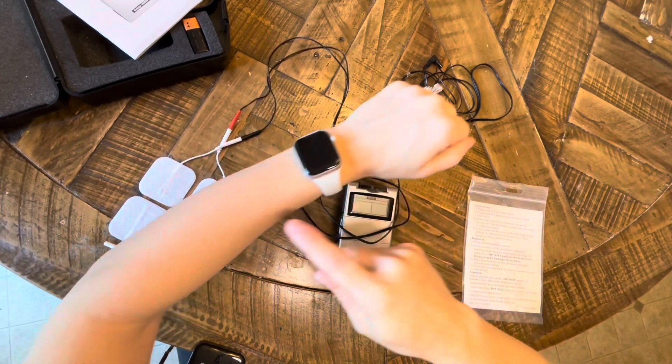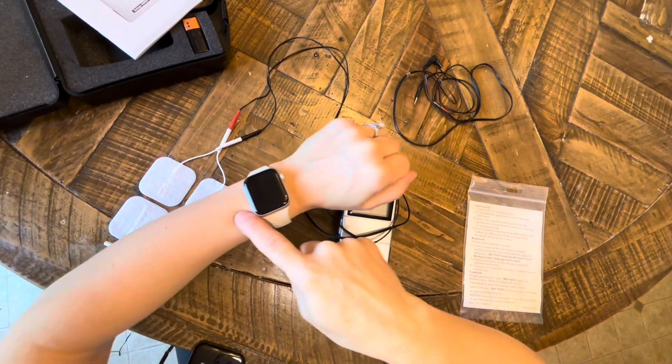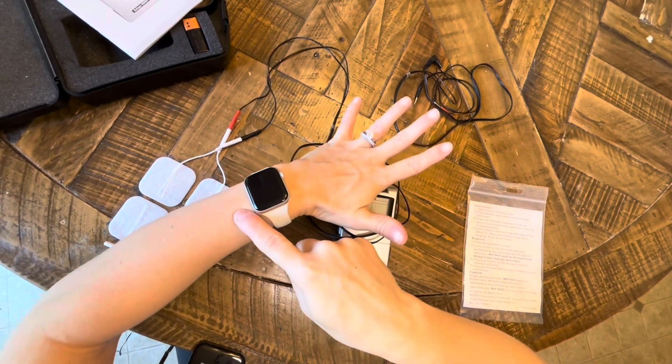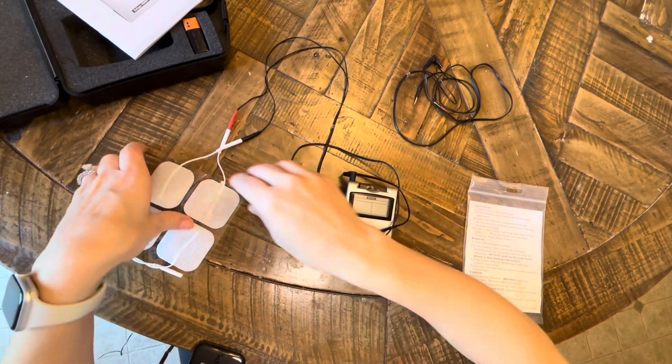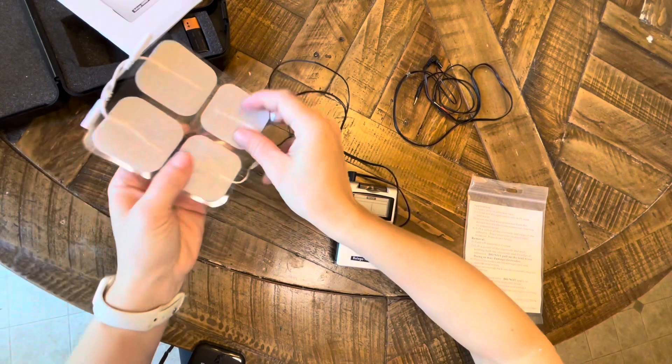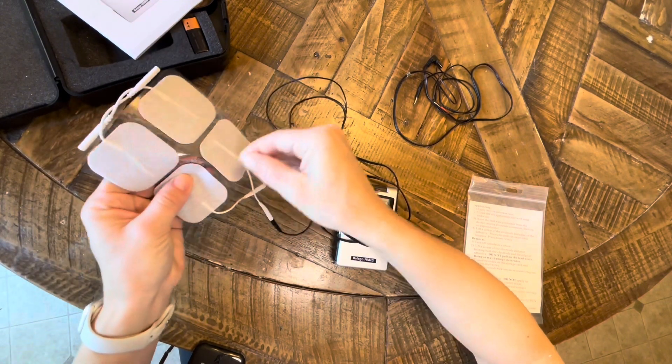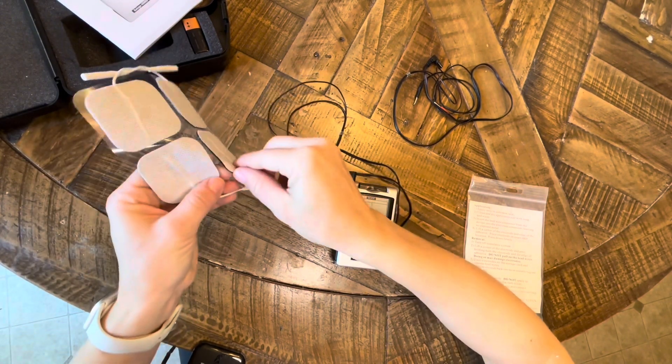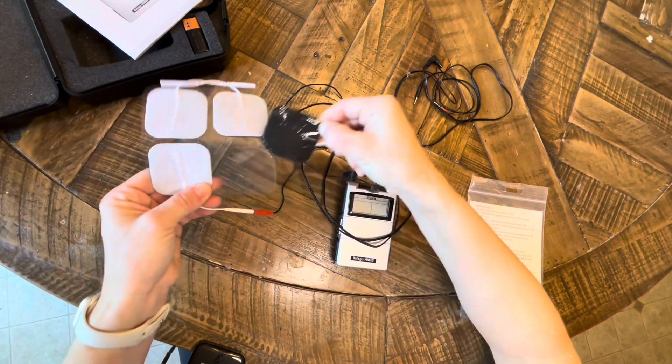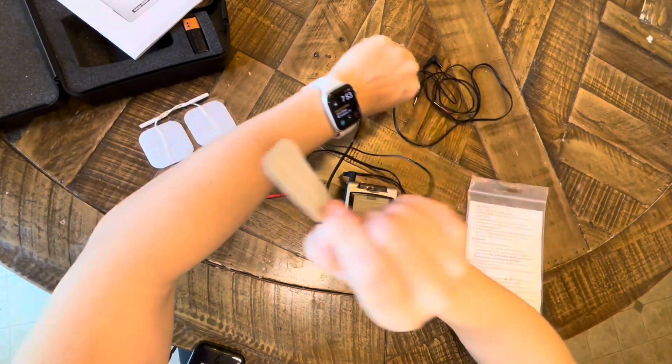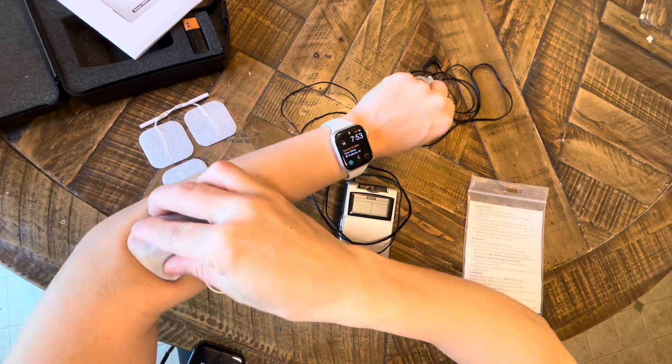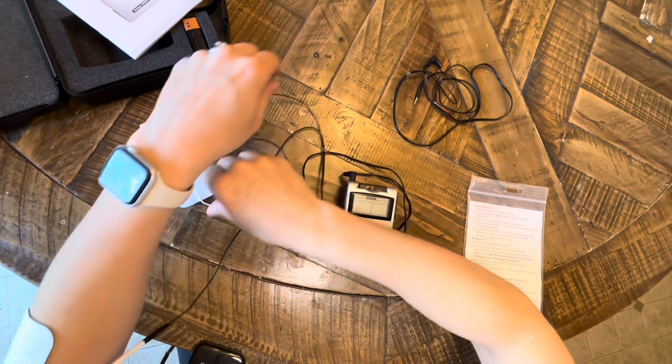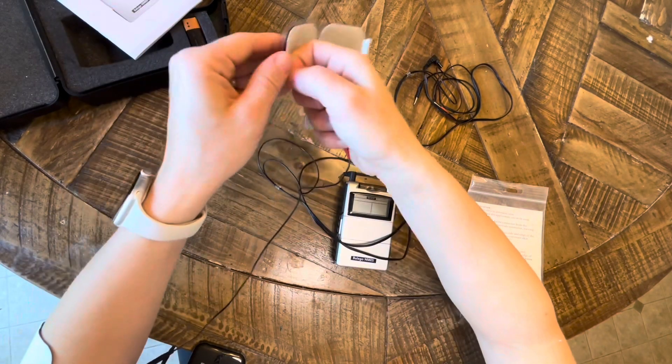I will place the electrodes on the dorsum of my forearm to get that finger extension. The Belego uses only symmetrical biphasic, so it does not matter where your red and your black lead is.